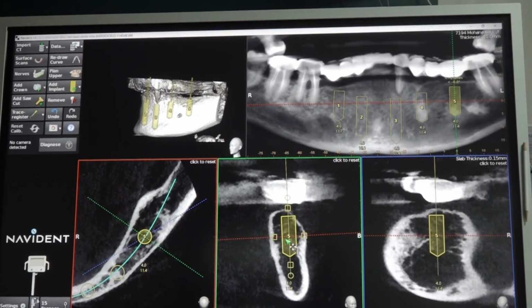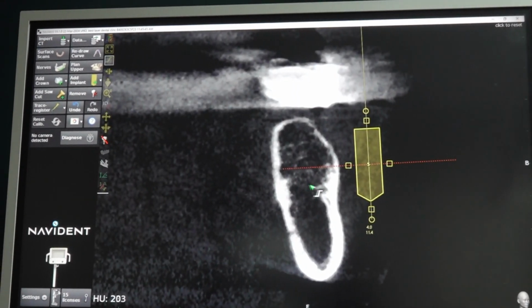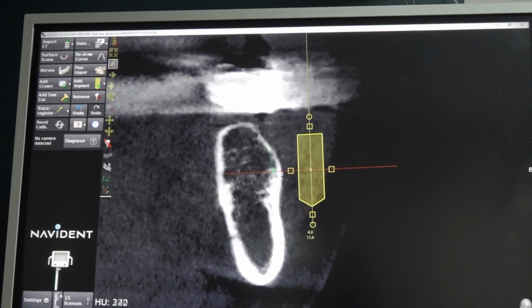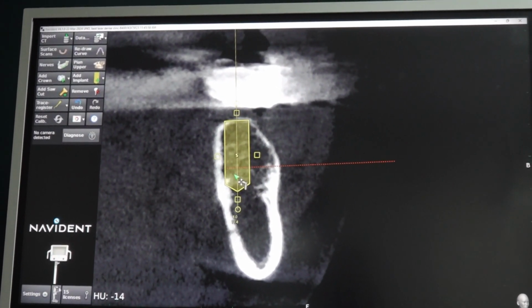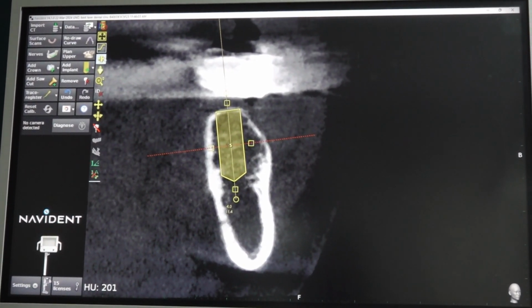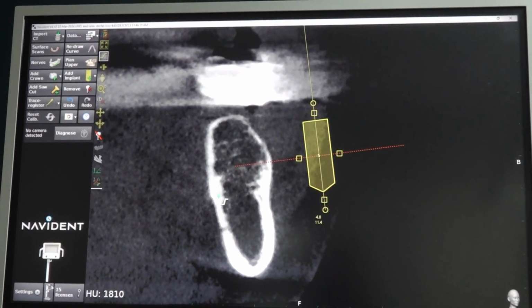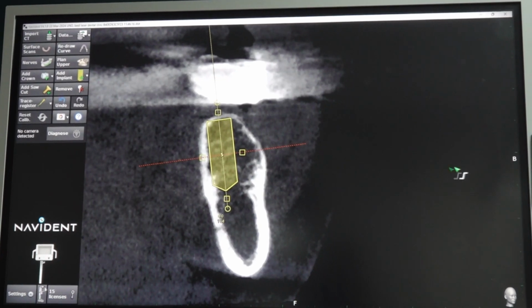This is the mesial aspect of 6. See, the bone is very much osteoporotic, very thin bone. Totally. Why not basal in this situation, sir? This is a very bad choice here. Because basal depends only on the cortical crestal threads. Here, where will you engage the crestal threads? Which is buccal. This is buccal, right?